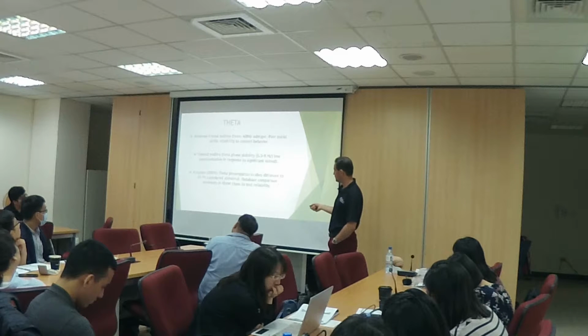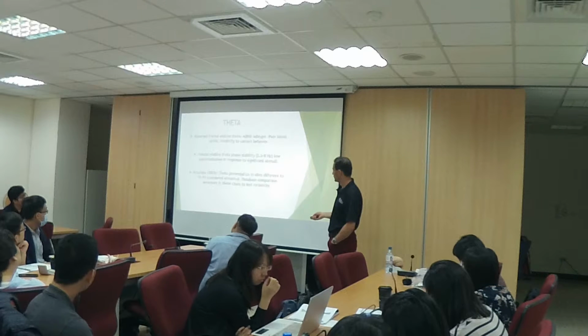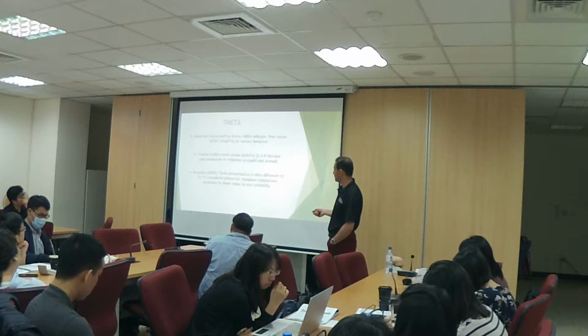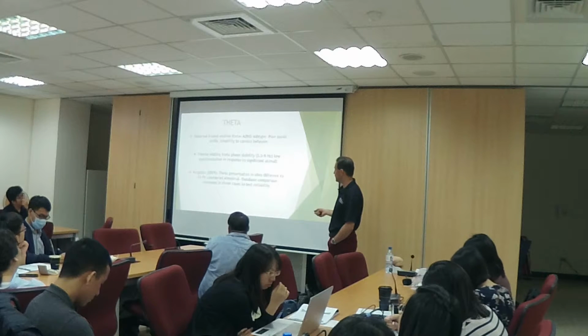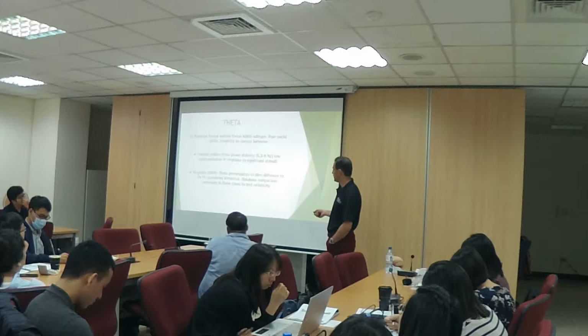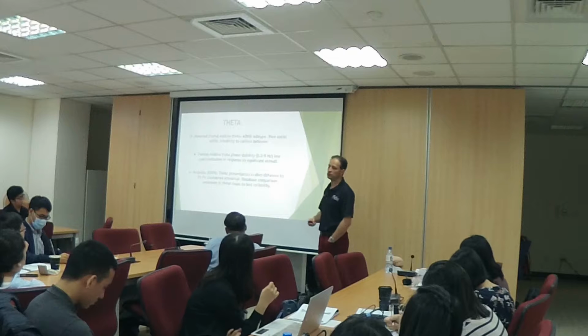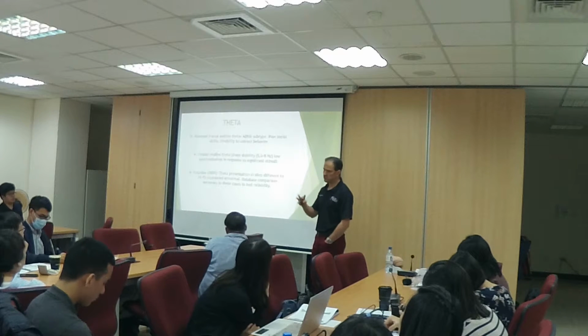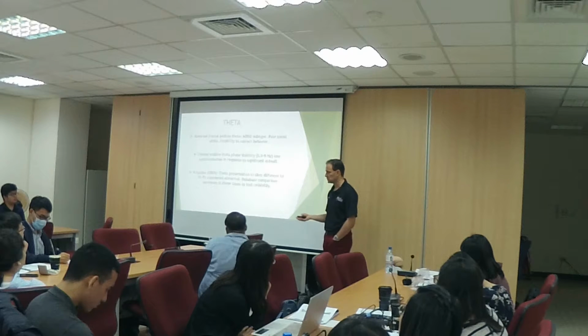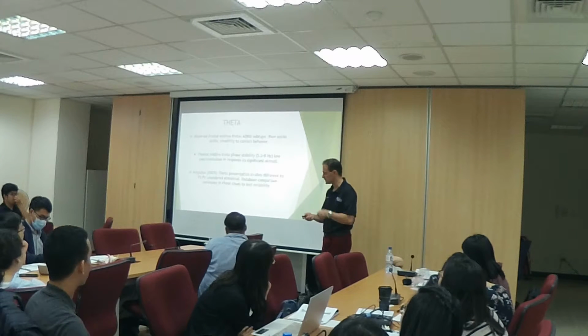So Kropotov, if you can get his book, he says theta presentation in sites different to FZ and PZ should be considered abnormal. So if you have theta anywhere else other than FZ and PZ, you need a database comparison. And you can use NeuroGuide or the HBI database. NeuroGuide is the most popular one in the market, created by Robert Thatcher in the United States.